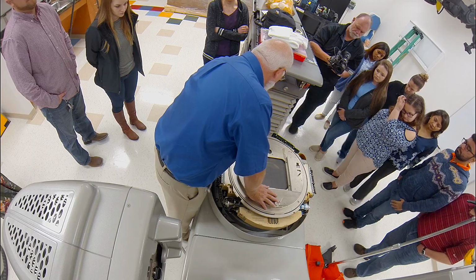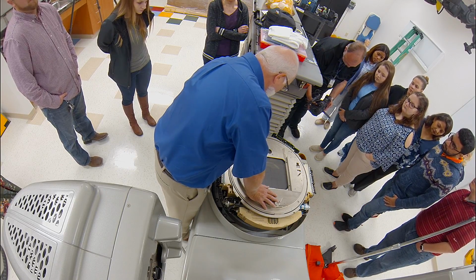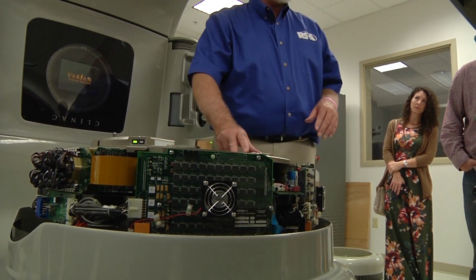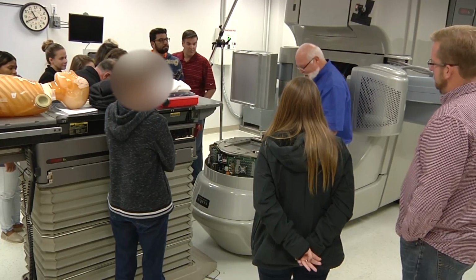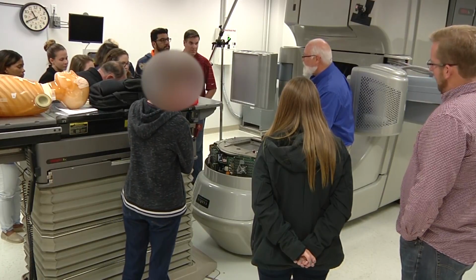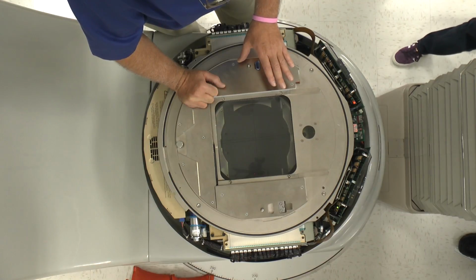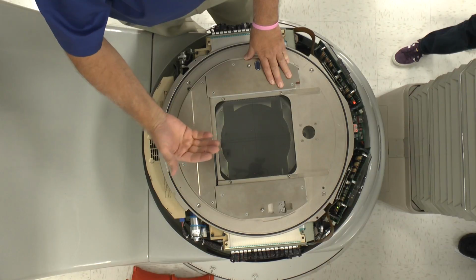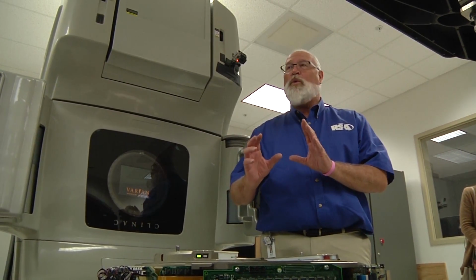On this system, we actually have a problem with leaf B4. B4 is not passing initialization. I'm hoping it's just a motor, but it could be this whole bank of this interconnect board. So we're going to replace the motor on that one, and then I'm going to have you each pull a motor out and put it in so you can feel what it's like.